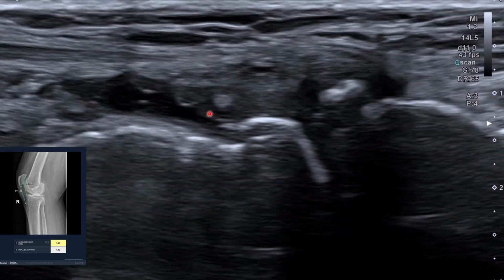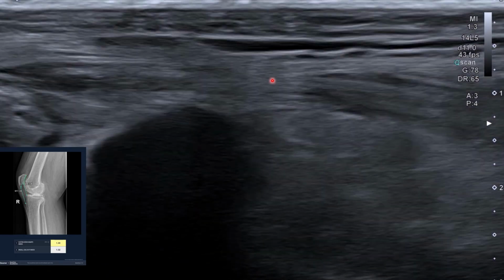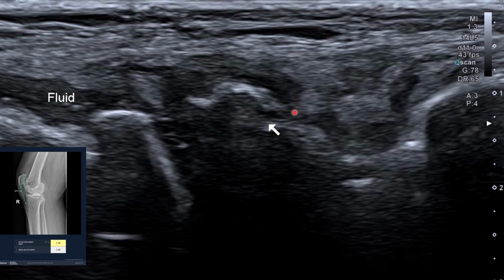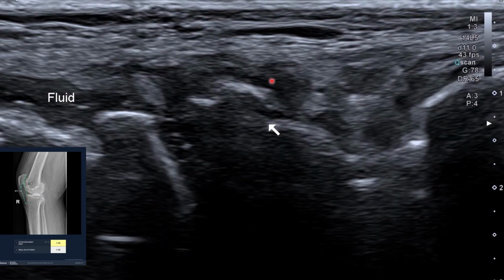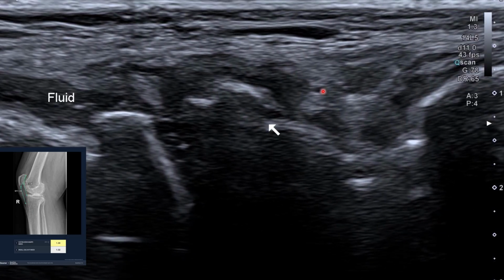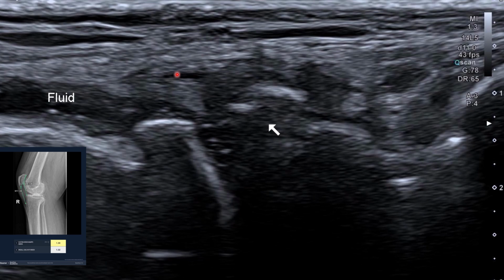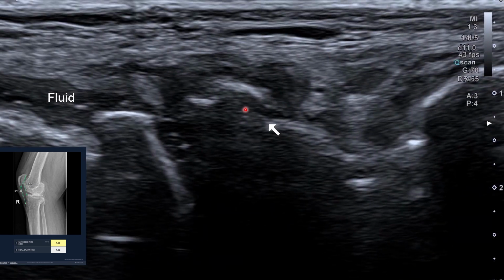So when it comes to ultrasound, this is an acquisition using a hockey stick probe. Now you can see the osteophyte, the free body nicely there. The hockey stick has got a superior resolution, and it can scan these superficial structures nicely. You can see the synovium, how thickened the synovium is there. There is synovial thickening there. I think you're appreciating it.